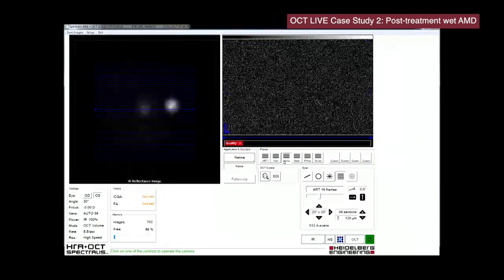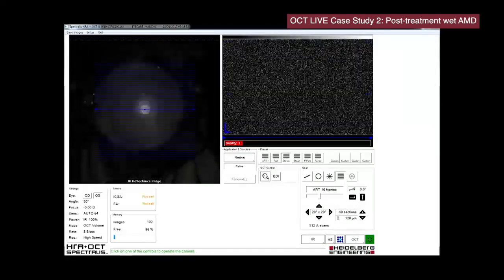Okay, that's fine, Phil. Thank you. Lovely. Excellent. Okay, if we can just escape there and we'll look at the images we've acquired.